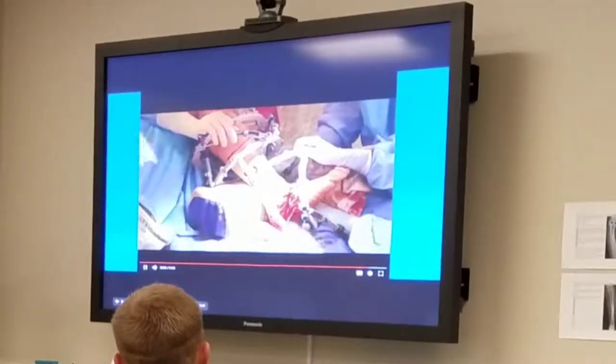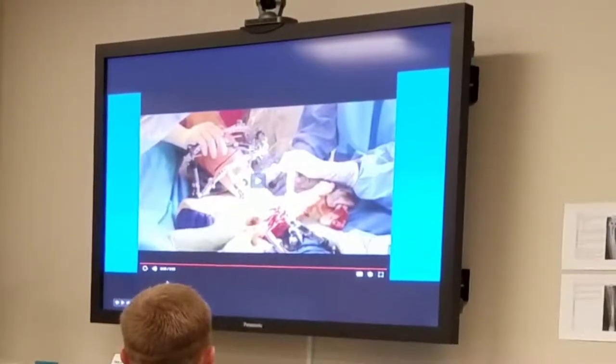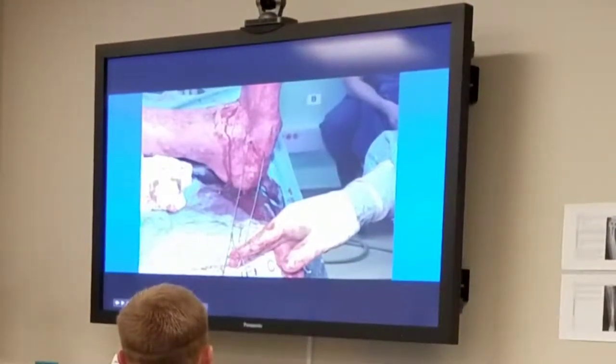Phil, you do these wet as well, correct? Yes, I'm not using a tourniquet on this. It also helps to cool the saw. I mean, there's very little heat in the saw anyway.